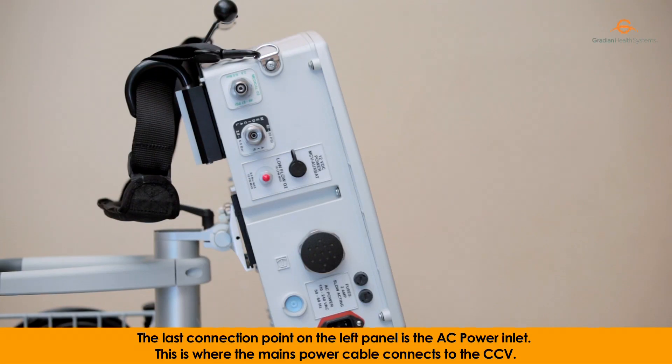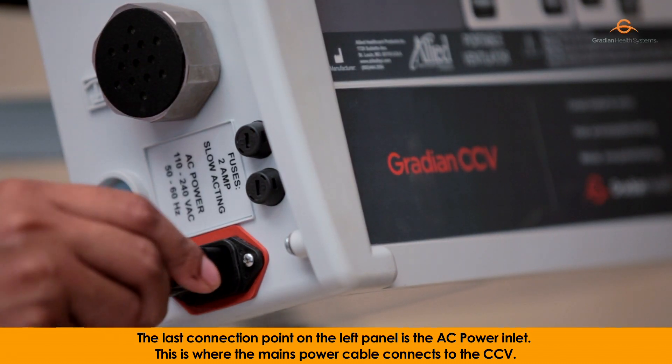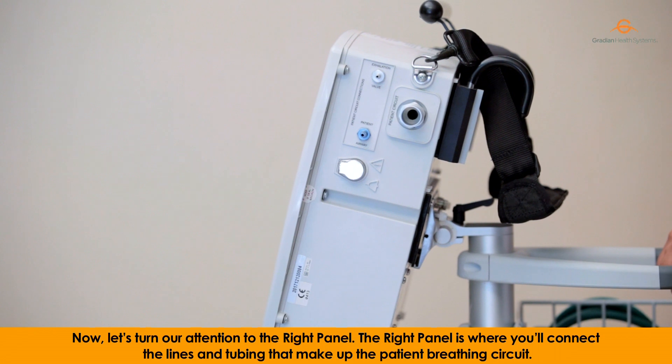The last connection point on the left panel is the AC power inlet. This is where the mains power cable connects to the CCV. Now, let's turn our attention to the right panel. The right panel is where you'll connect the lines and tubing that make up the patient breathing circuit.